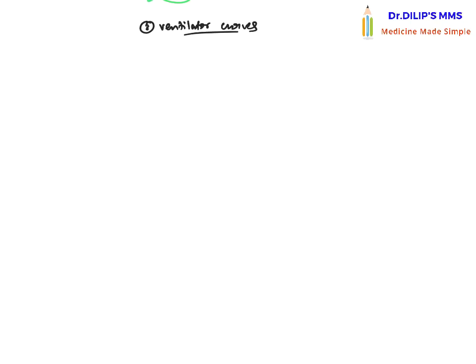The curves have a lot of things. For example, curves might have a sinusoidal pattern, or a square pattern like this, or an exponential pattern like this. A lot of things are there about the curves, but these are the basic curves which I see in my ICU, so I'm going to use these curves to explain what is really happening. First of all, there are three types of curves in the ventilator. First, you have the pressure curve. Second, you have the flow curve, and third, you have the volume curve. So this is what you're going to look out for.